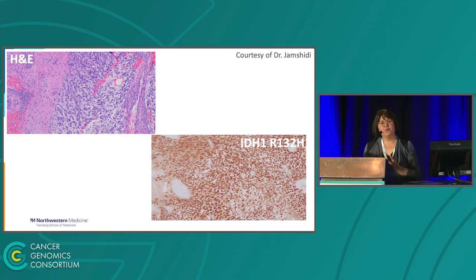So now if we move from primary CNS tumors to still intracranial tumors, and we see quite a lot of those, when the cell of origin, the tumor of origin, is not really clear. What our brilliant bioinformatics team did, they validated a classification system based on methylation data, because methylation is so powerful for identification of cell of origins. First for carcinomas, and now they continue adding tumors. Now that pipeline is called tumors of unknown origin.